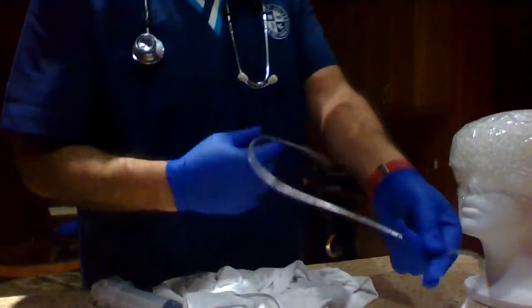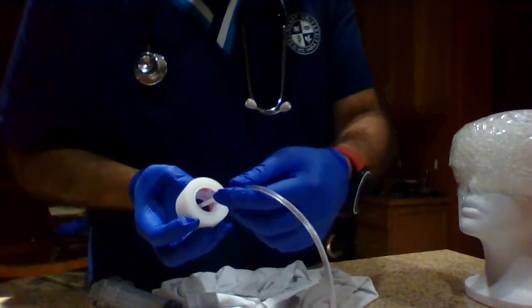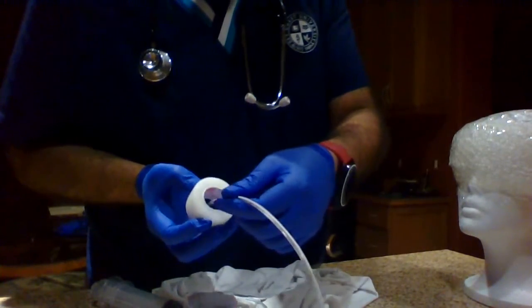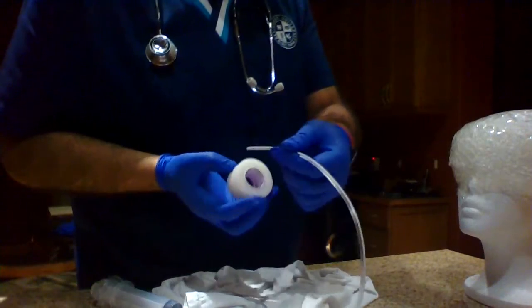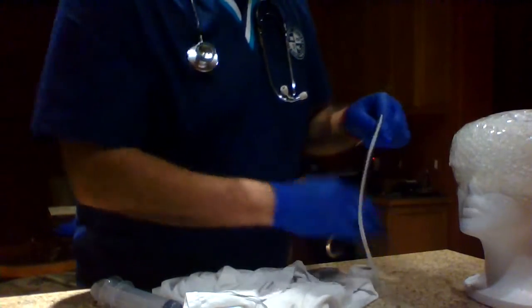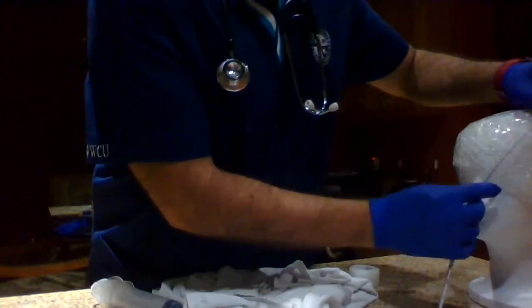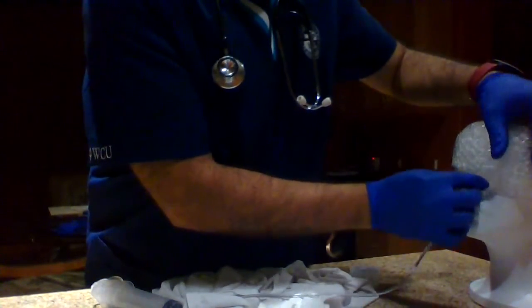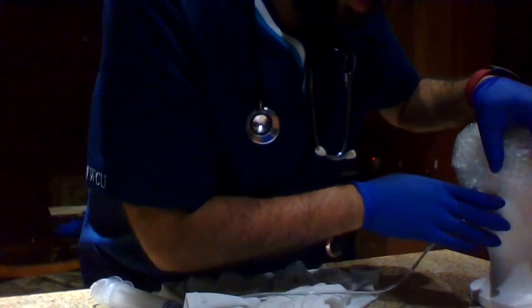Let's pretend that's your naris. You have to make sure the tube is not touching the skin, because that could cause a breakdown, and you do not want that so close to that area. So when you're putting it in there, you make sure of that. So when you put the tape, now you have to check to make sure.